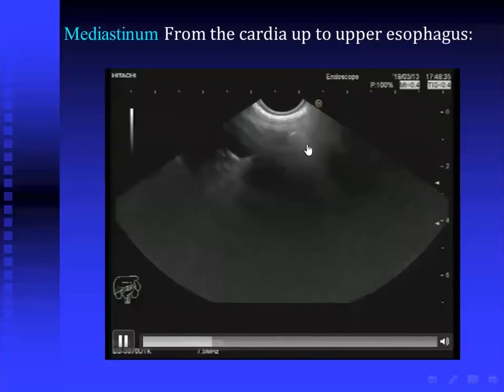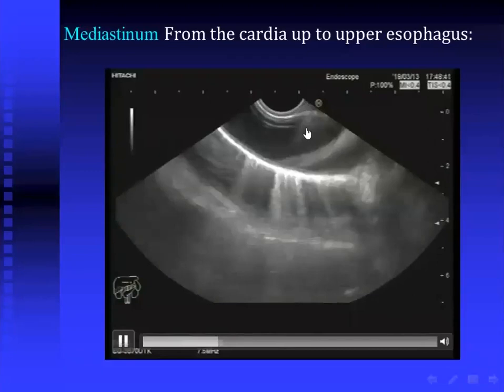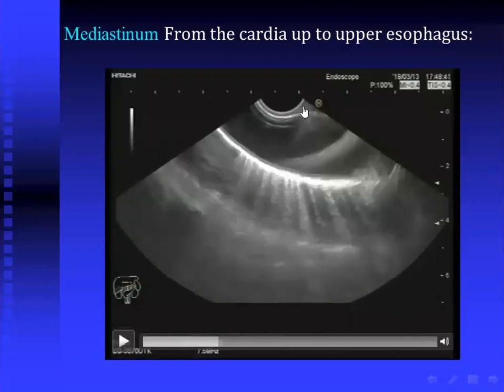Yes, I am doing it now. This is the lowermost part of the trachea, and this is the aorta. Here, very nicely seen, the aorta. And here, this is station 8. So I saw station 9, and then with upward withdrawal of the echo endoscope I saw station 7, and then half a circle clockwise or anti-clockwise rotation to find station 8.